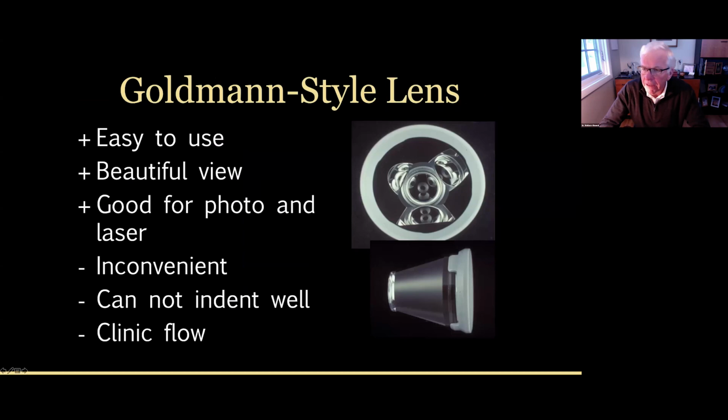There are advantages and disadvantages to both of these, and it's important to understand those, because I think it's really useful to have both lenses available. The Goldmann style lenses are easier to use, and the view is spectacular. They are the lenses you're going to use for photography or laser treatment. If you're looking with a four mirror lens and you just really want a better view, I wouldn't hesitate to pull out a Goldmann style lens to give you a different view.